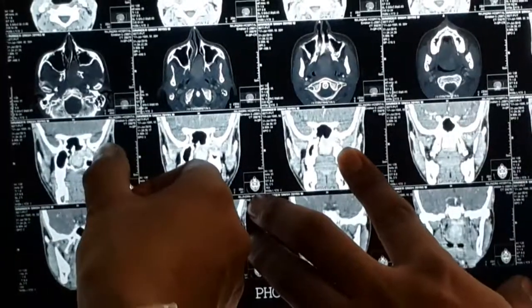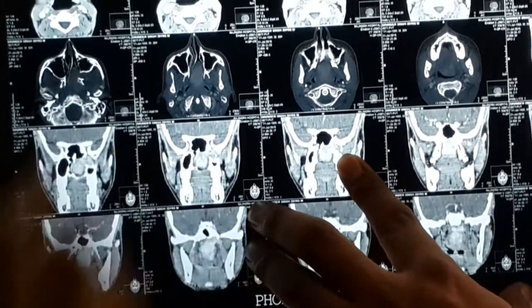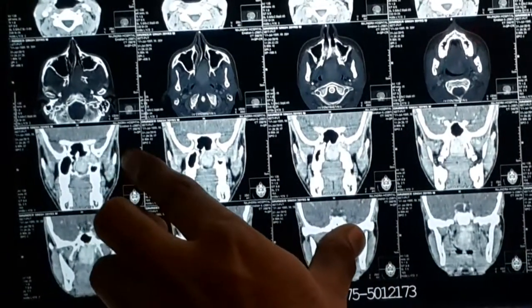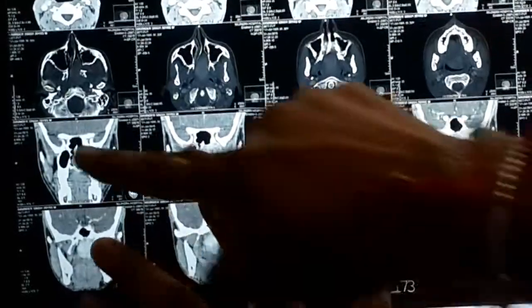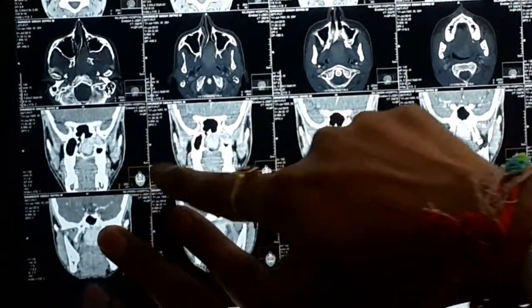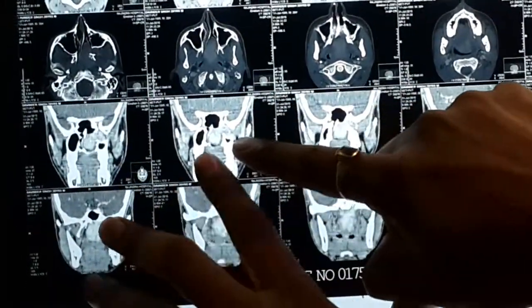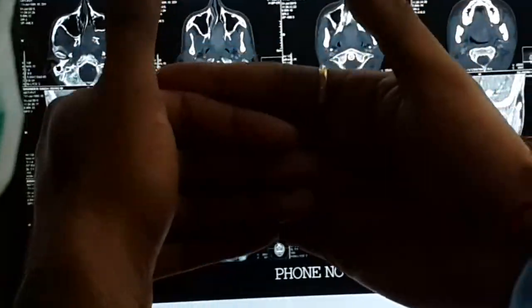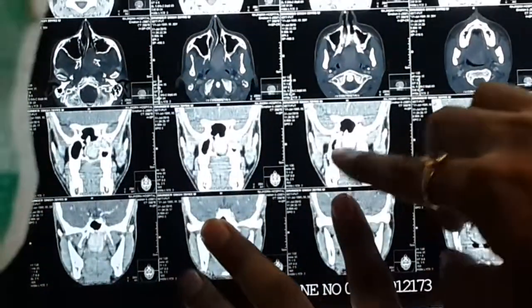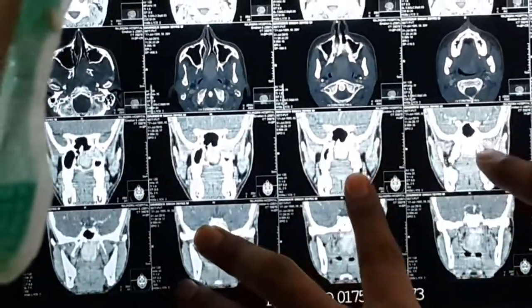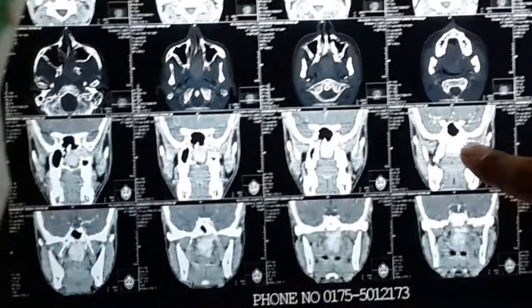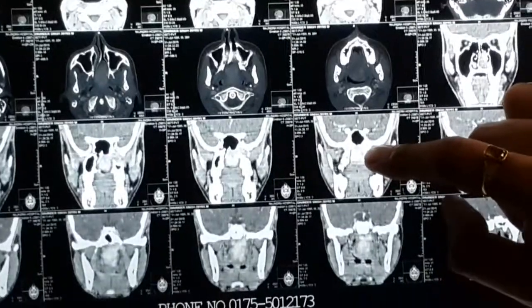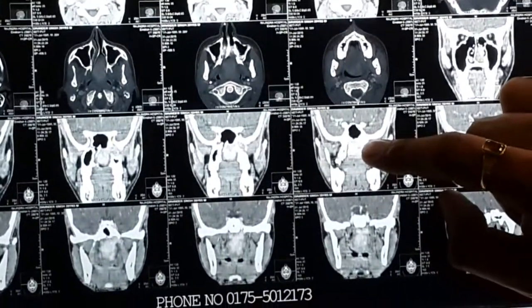This is the pterygomaxillary fissure — it is not going beyond that. Now we are going from anterior to posterior: maxillary sinus, behind that is pterygopalatine fossa. Behind that, what is going to come? This is the pterygoid process. The pterygoid process is not eroded — see, it is pretty intact. It is not going behind that. Had this tumor been going behind the pterygoid process, behind that is the parapharyngeal space.